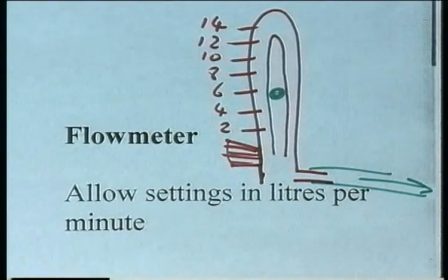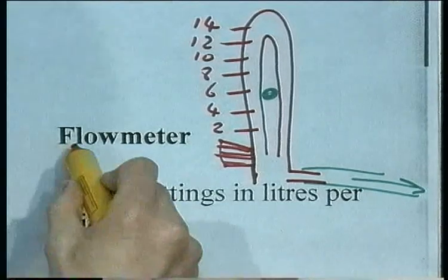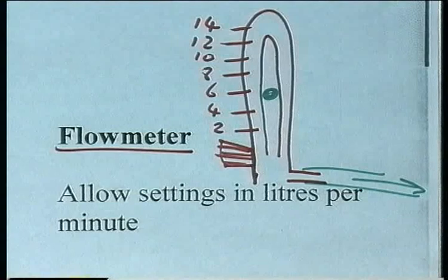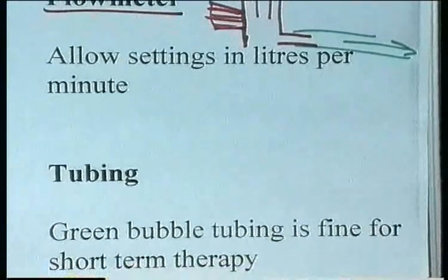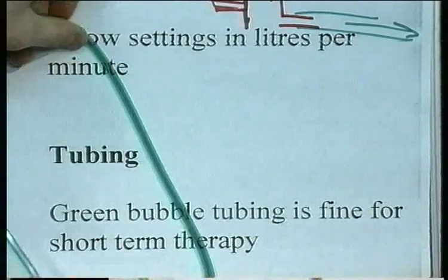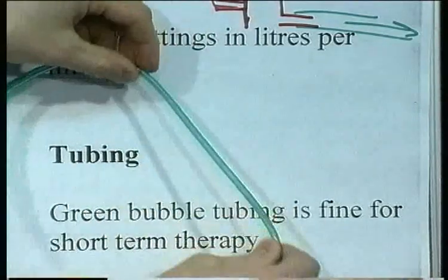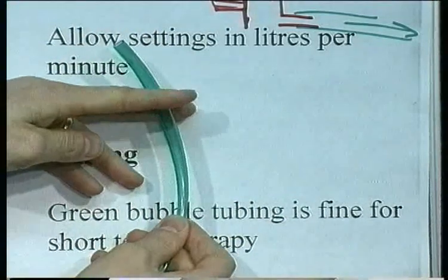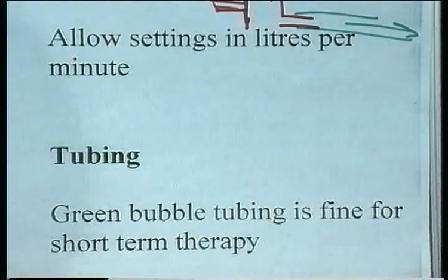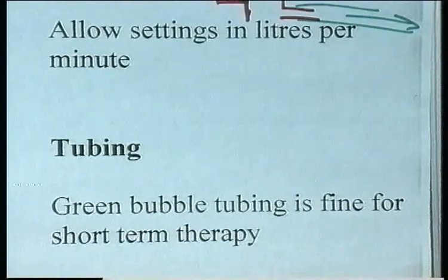All the flow meters I've seen have always been in liters per minute, so it's normally quite straightforward to set the flow. For tubing, we often use this green variable-length type tubing — we call it bubble tubing. It's got thicker bits and thinner bits so you can cut it at a thick or thin bit to ensure a good seal around the mask or source, otherwise the oxygen will just be leaking.